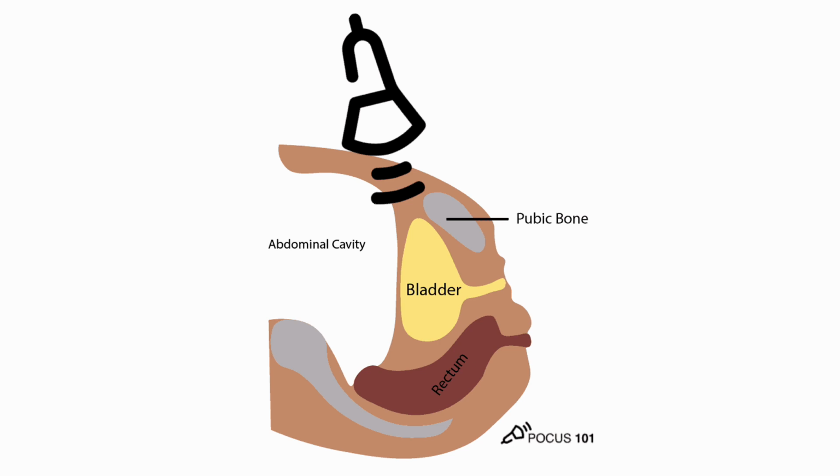This can be a difficult study to get. If you don't see anything, also ask the patient if they urinated recently, because if they don't have any urine, you're not going to see anything.